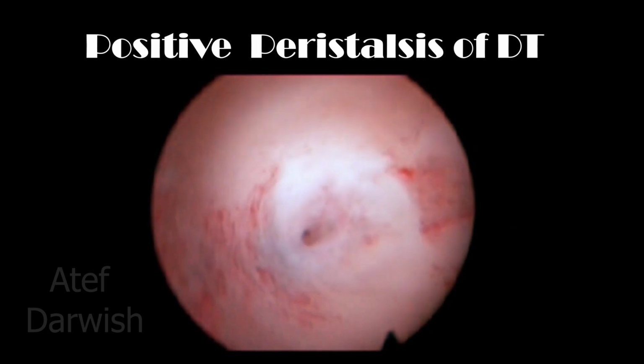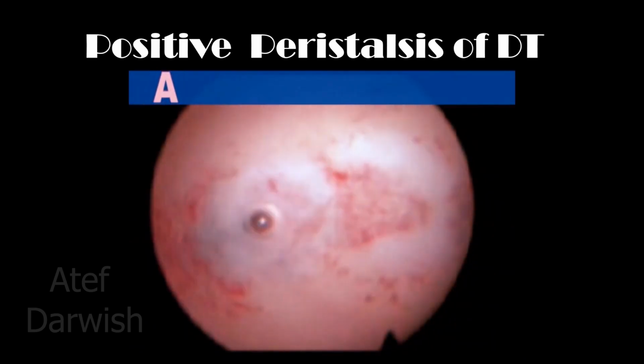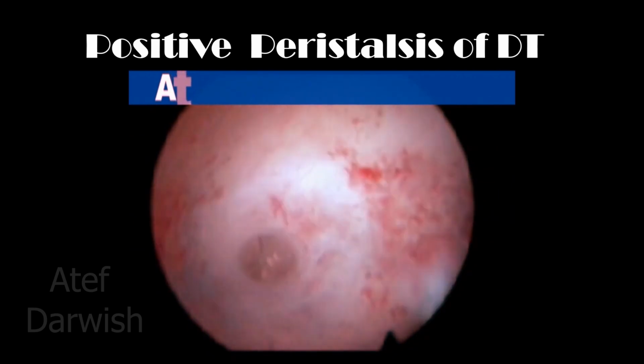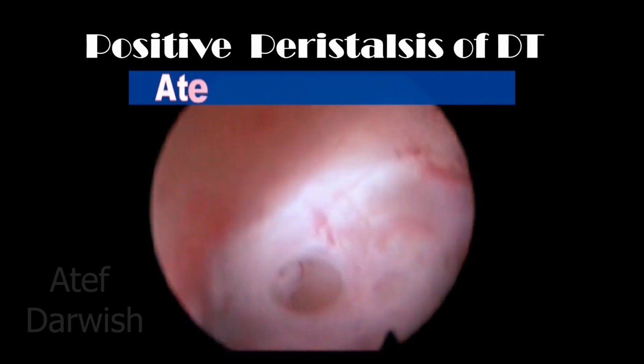In many cases, if you look at the Darwish triad, you will see the contractions and relaxations of the ostium during examination, showing positive peristalsis.